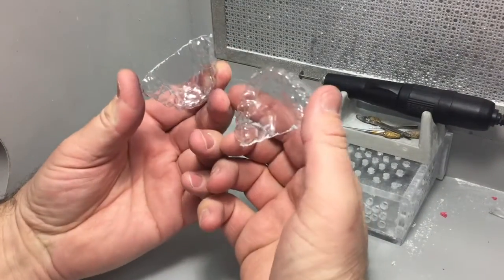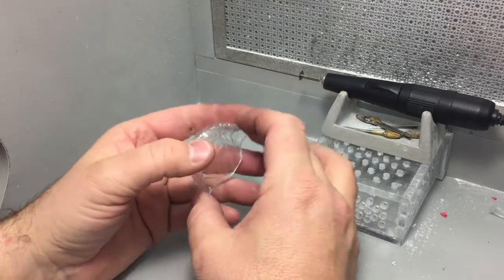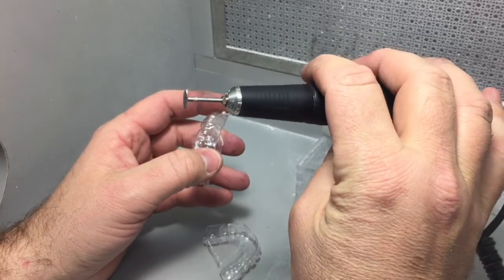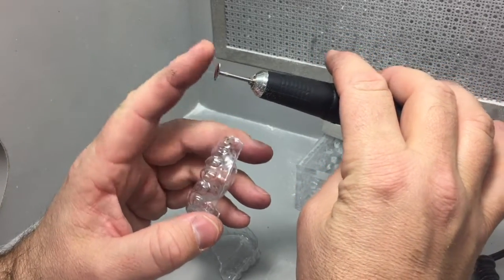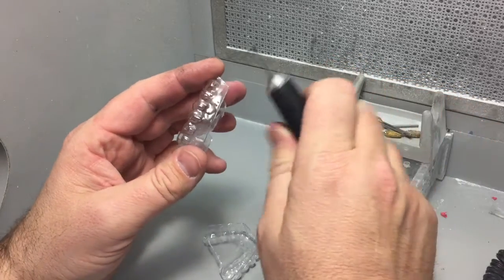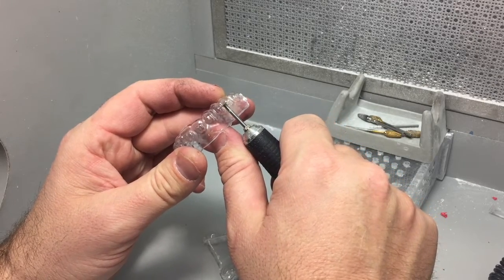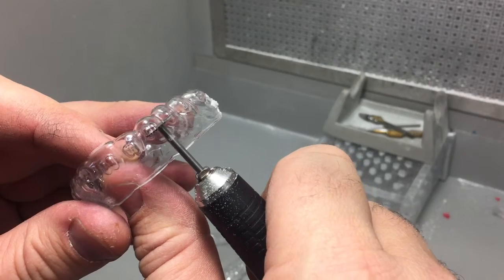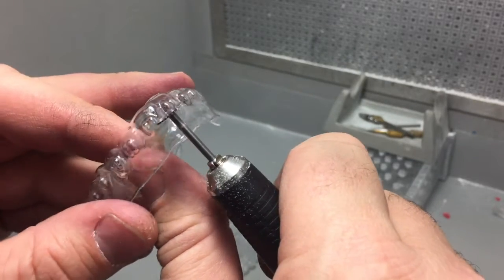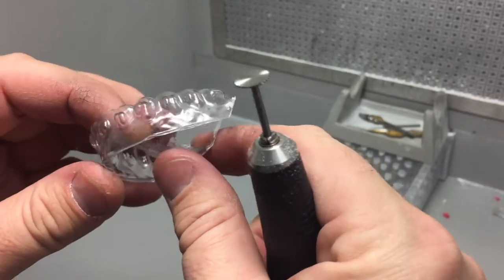Now we need to trim the hard Essex tray. We're going to take a saw blade — brand new, only ever used on Essex, not on stone or anything like that — and cut right across the middle of each one of those brackets. It's going to cut right across here, cutting those brackets in the sports mouth guard material.